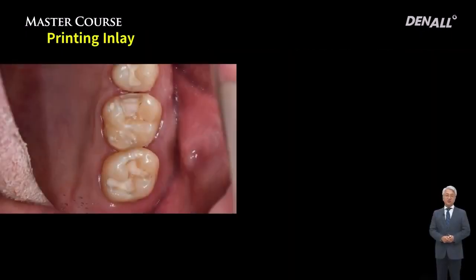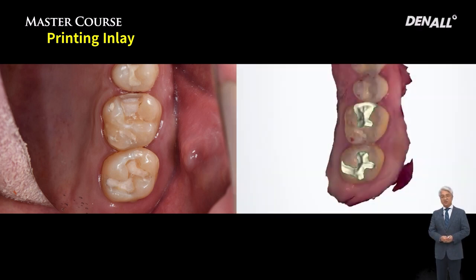In our dental clinic, in the past, I used a milling machine to fabricate inlay, but now I am attempting to fabricate inlay using 3D printing. The clinical results of 3D printed inlay are very good as well, so let me show you this case.